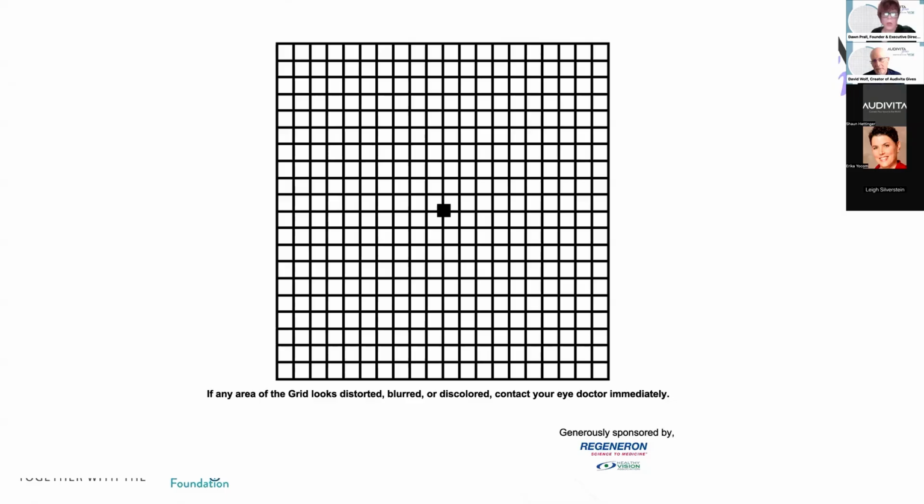We're going to pop up a poll in a second, but this is basic, and you do not see with your eyes, you see with your brain. So this Amsler grid may or may not look different on a regular basis when you use it. But this is the gist of it.